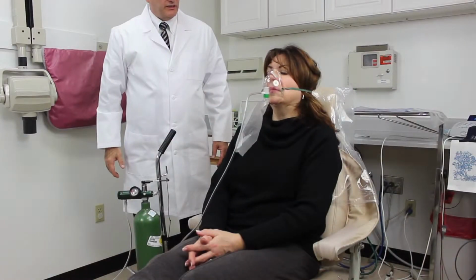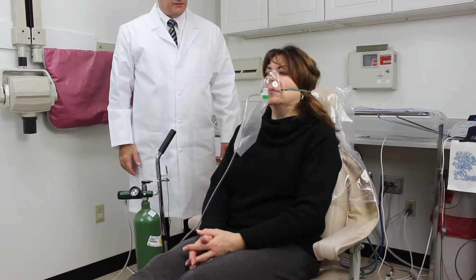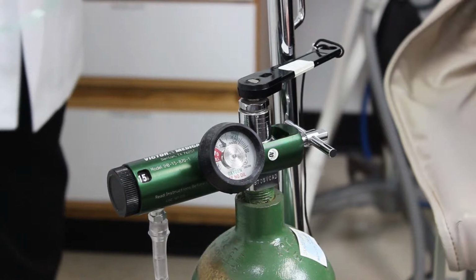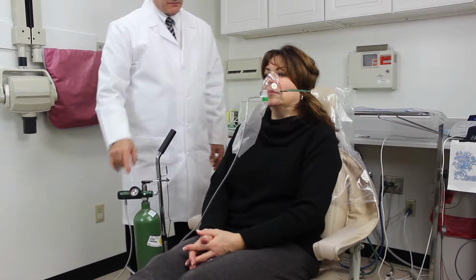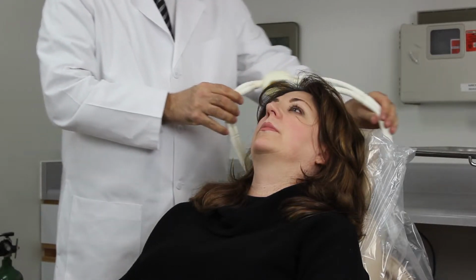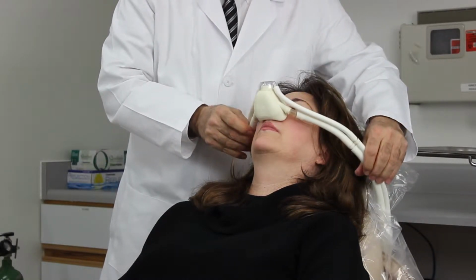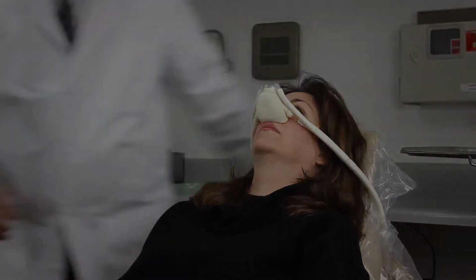The non-rebreathing mask is demonstrated here, and it is placed in a similar fashion as the nasal cannula. Run it at 10 to 15 liters per minute, and it will be capable of delivering 60 to 80% oxygen. This is better for distressed patients or for patients who are in a definite need of increased oxygen. The nasal hood, as used with nitrous oxide in our office, can be run at 4 to 6 liters per minute, and its capability of delivering oxygen is somewhere between the nasal cannula and the non-rebreathing mask.